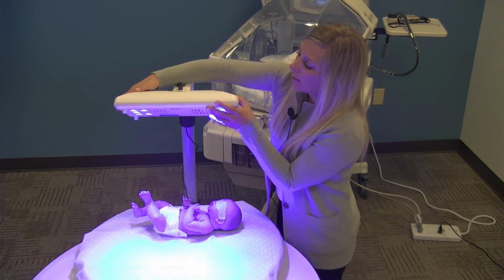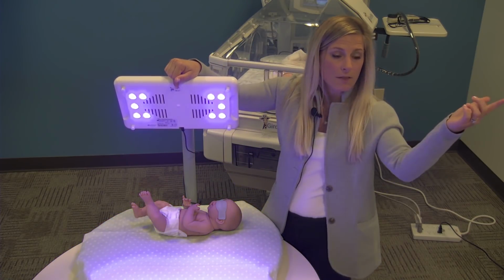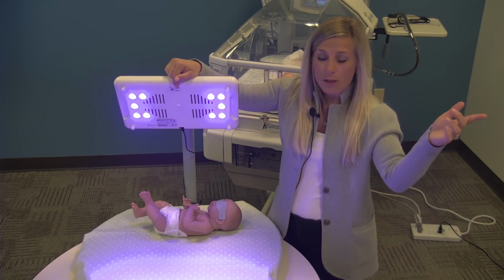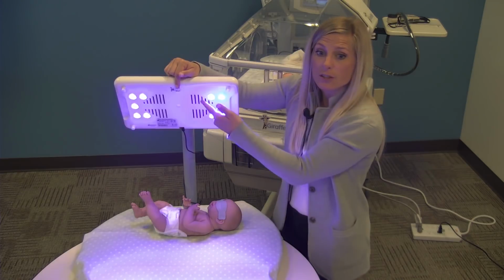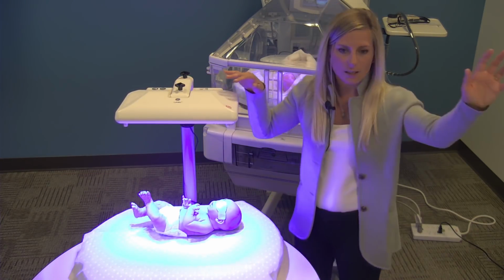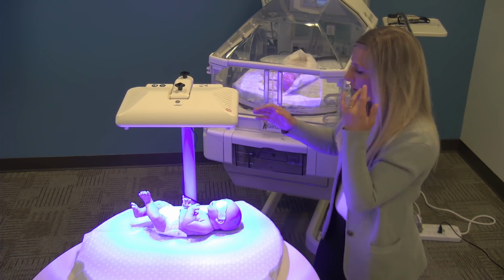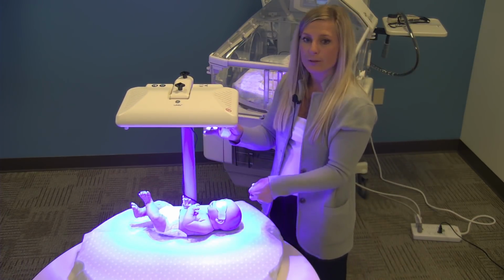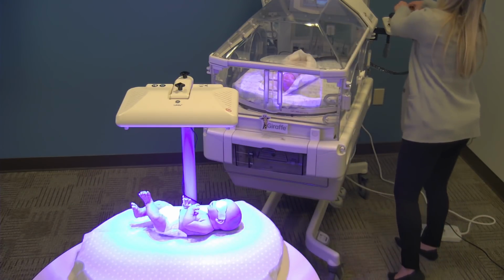On the Lullaby, on the bottom, you have the measurement. So just like on the cone over on the BiliSpot, we've got a measurement over here. Now that's 38 centimeters. This is 35. The difference comes out to be about 14 inches here, 15 there. So pretty similar in terms of that. So you'll want to do your measurement from the baby, and then of course we will grab our bili meter.